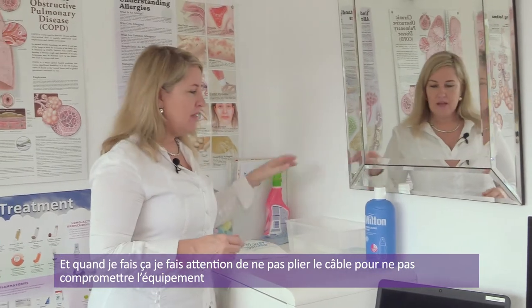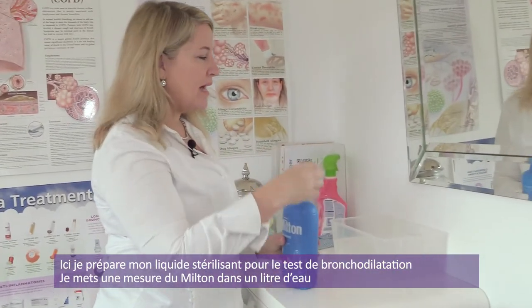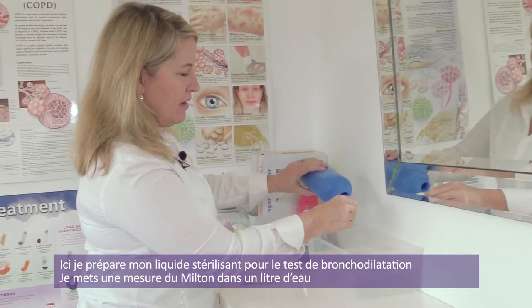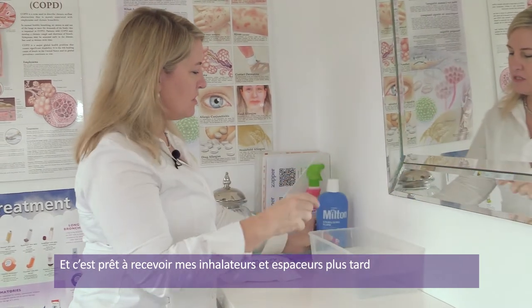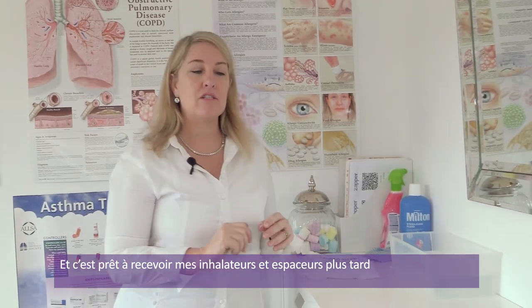equipment as I go. Here I prepare my sterilizing solution for my bronchodilator test. So this is Milton. I just put a capful of the Milton into a liter of water, and that's ready to take all my metered dose inhaler tubes and my spacers for later on.